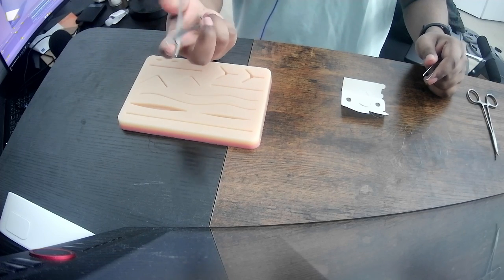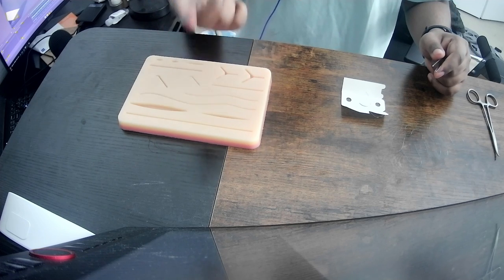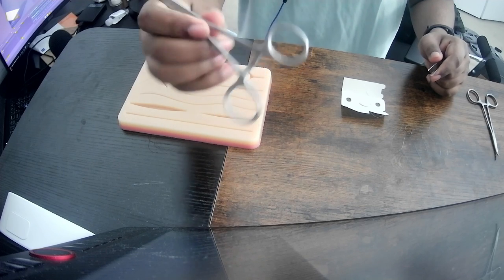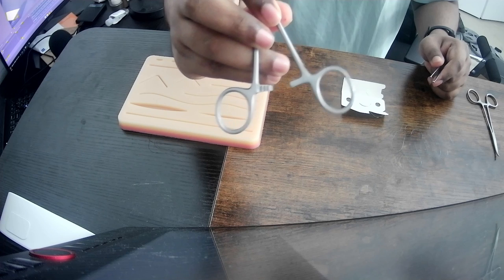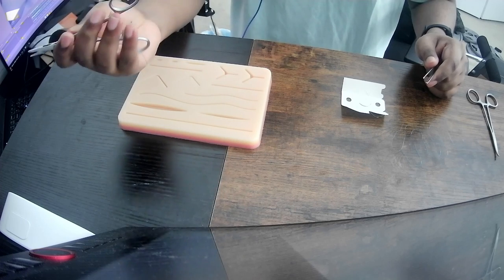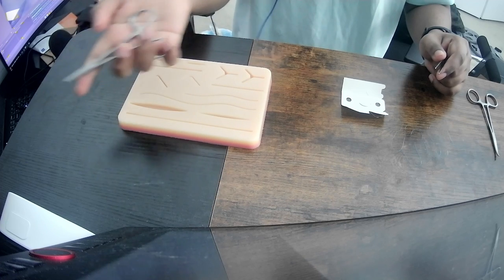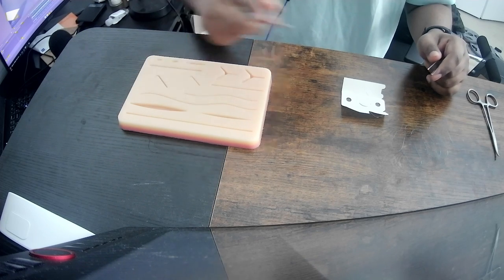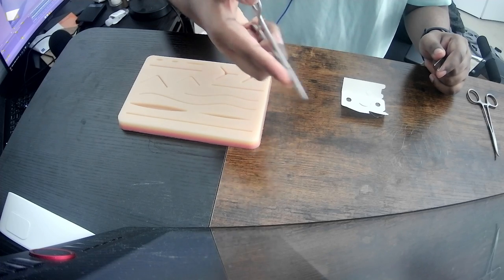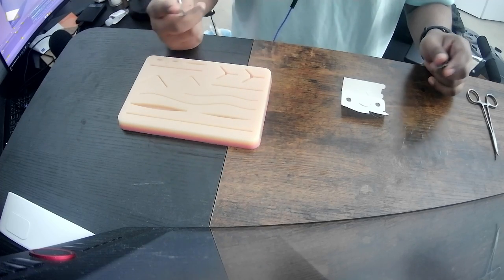I've been practicing just handling the tools, like operating, palming the needle driver. This right here, needle driver. Nice little tool. It's got serrated teeth on one end. And it locks. It's a locking mechanism. Once it's locked, you basically take a bite of the needle, you hold the needle, it's called a needle driver, you hold it, lock it in, and then you can drive it however you want.